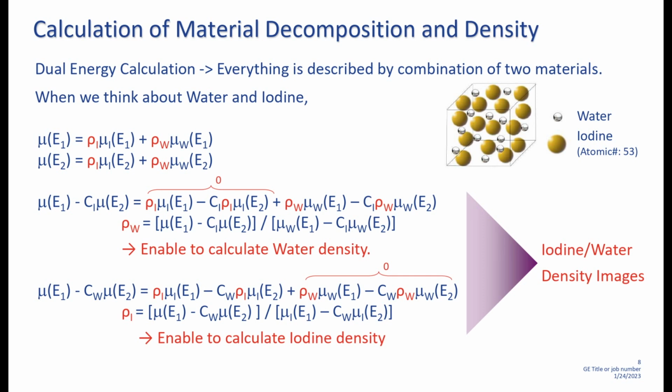Because one box will contain both iodine and lipiodol together. So it will be a sum of the attenuation, and iodine is more prominent. Compared to fat, attenuation is very low. So the attenuation contribution is more from the iodine part of the lipiodol. So it will work similar to iodine material. I have this case of a follow-up.